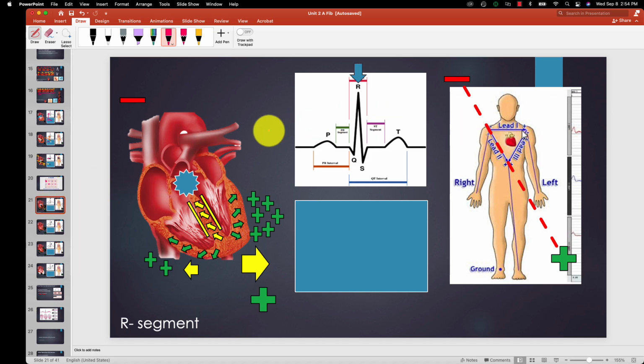You need to understand how the physiology is communicating with the machine. And you're like, oh, I get it. The Q wave's messed up. It doesn't look normal. So that means something is going on here. All right. Let's move to the bundles of His, and let's move to the Purkinje fibers as well.